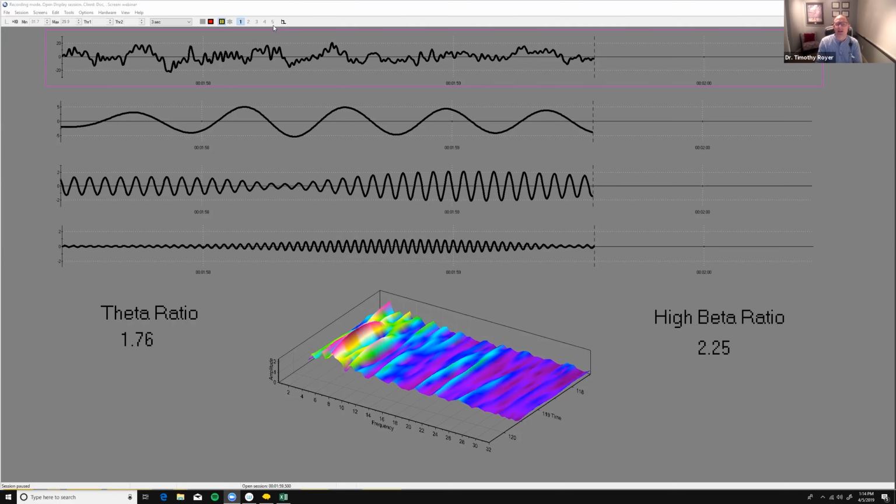They get represented more, or they're dominating the brain, when the amplitude of that frequency gets stronger, or higher. And we're going to see that in a second.